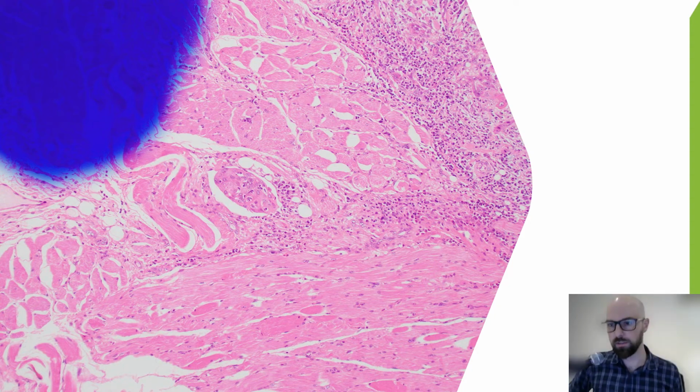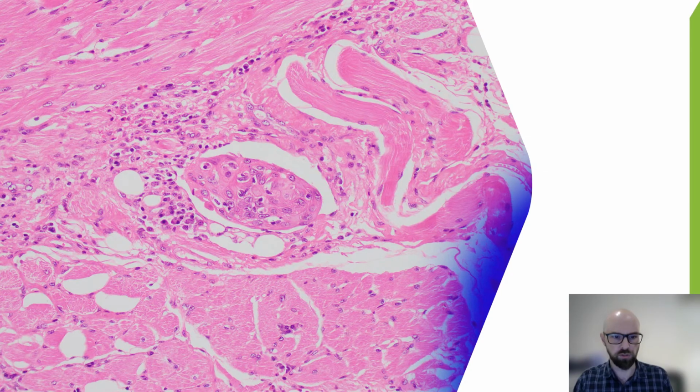A pretty common difficulty though is trying to distinguish tissue retraction from actual lymphovascular invasion. And so when the tissue fixes, what happens is you can get contraction, and the planes of the tissue can separate out, and then you can get this kind of clearing of spaces here. And you can get the same thing around tumour nests. So it can make it really quite difficult. And so zooming in on this, we can see the tumour plug there. Possibly we've got some endothelial cells here.